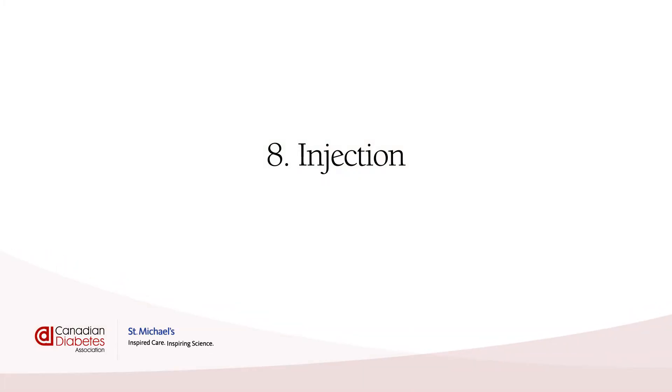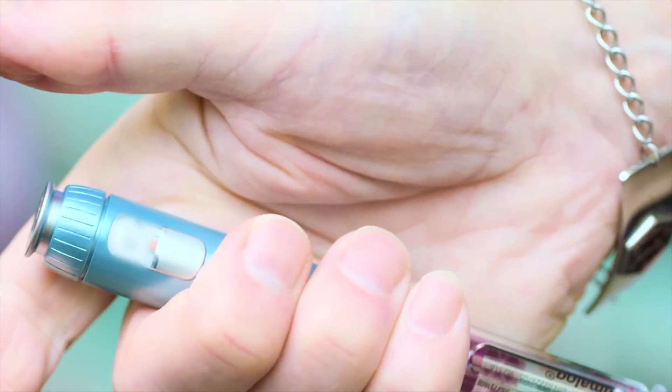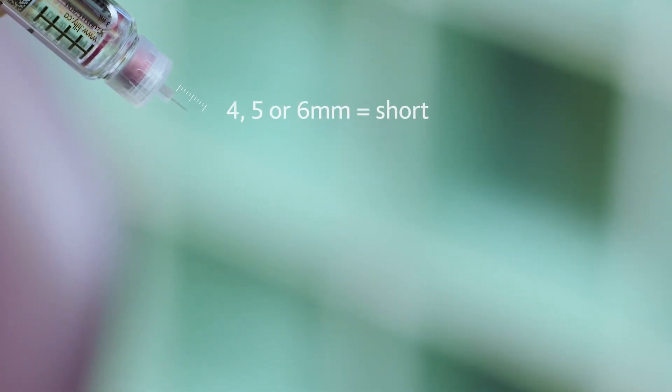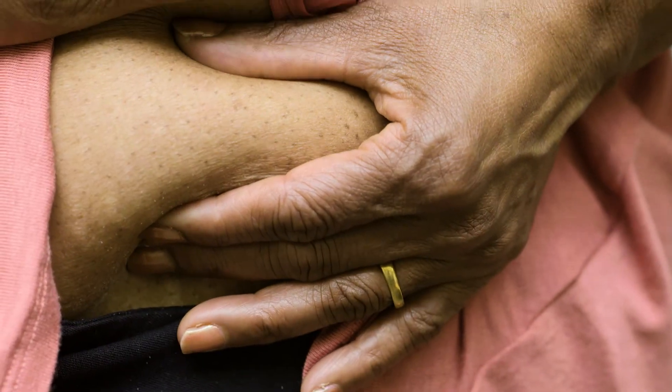Injection. Hold your insulin pen in the palm of your hand with your fingers wrapped around the pen like Paul. Look down to make sure you see the right number for your dose in the window and have your finger ready on the injection button. If you use a short needle — four, five, or six millimeters — you don't have to lift your skin when you inject. If you are using an eight millimeter needle, which is longer, you will need to lift your skin like Nora. If you don't know your needle length, check your box.